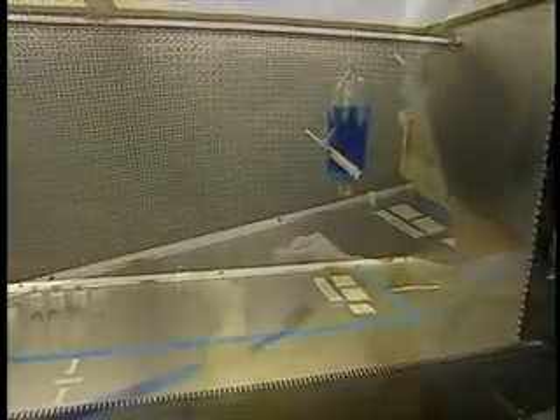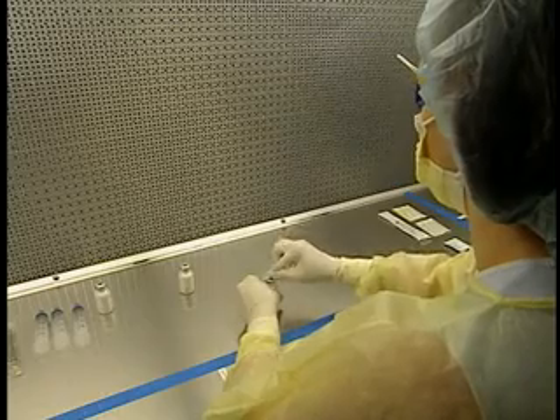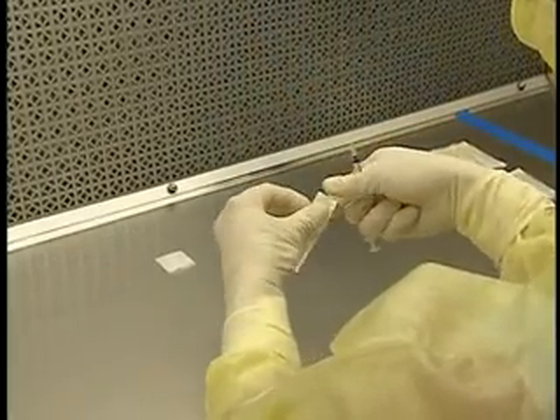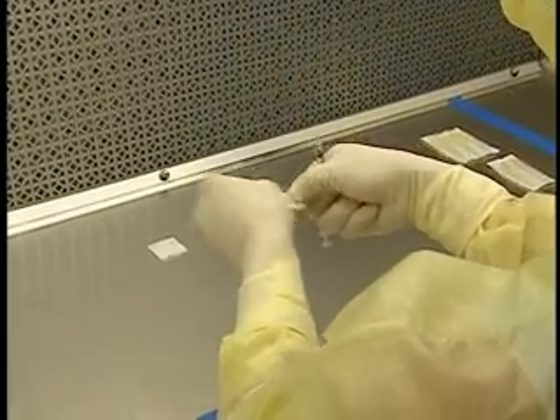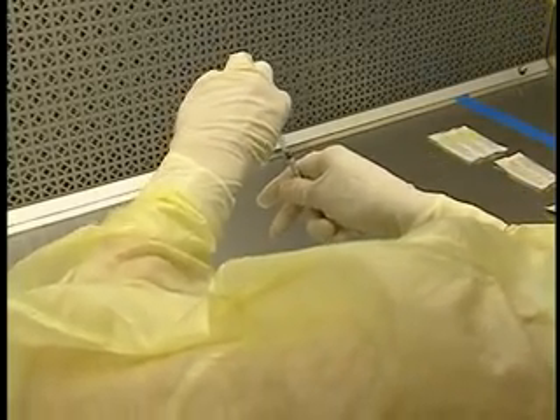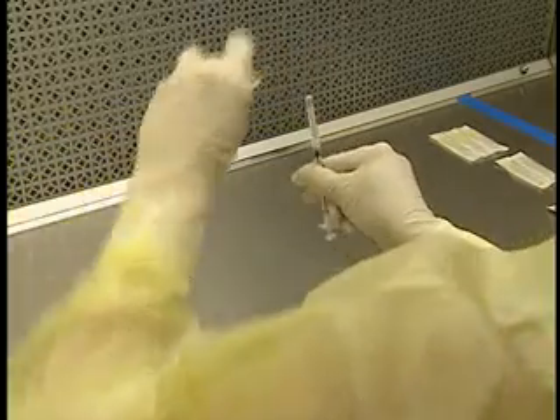Though a horizontal laminar airflow hood provides a controlled work environment, it does not protect either the handler or the outside environment from aerosols or particles generated during manipulations. For this reason, these hoods are used only when compounding sterile products that do not present a risk to the handler or the environment.